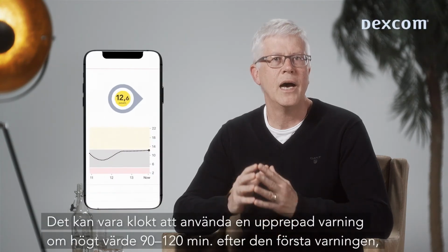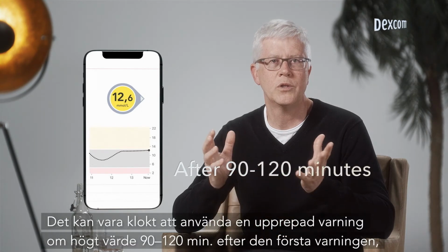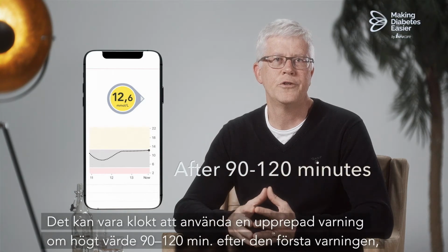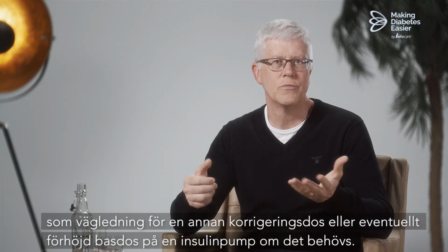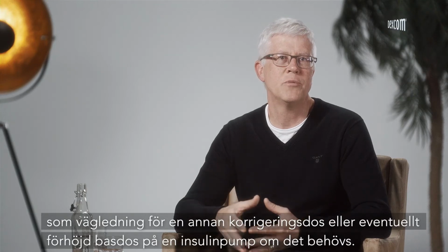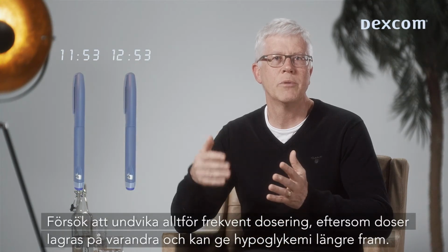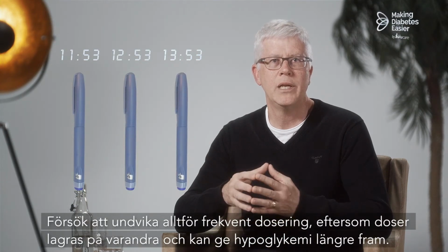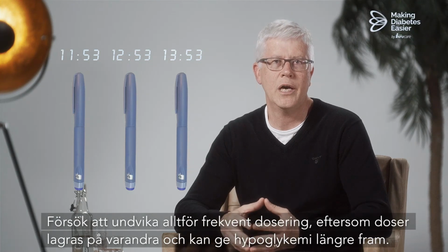A repeated high alert might be wise to use 90 to 120 minutes from the first alert as guidance for another correction dose, or possibly a raised basal dose on an insulin pump if needed. Try to avoid too frequent dosing, as this will lead to insulin stacking and further risk of future hypoglycemia.